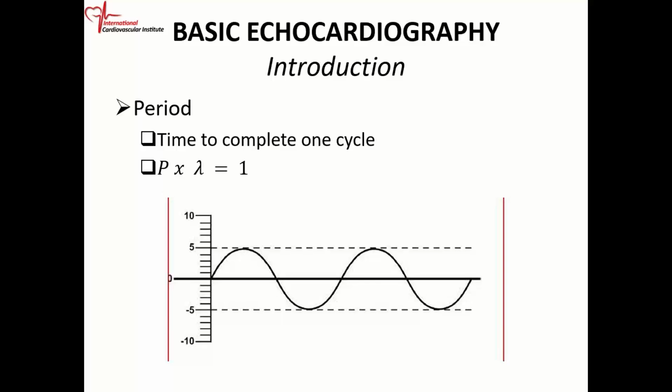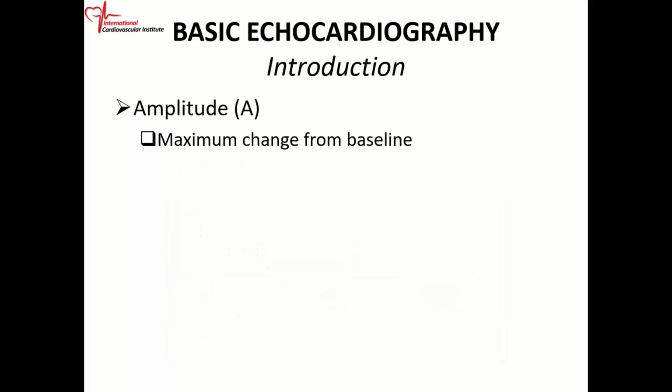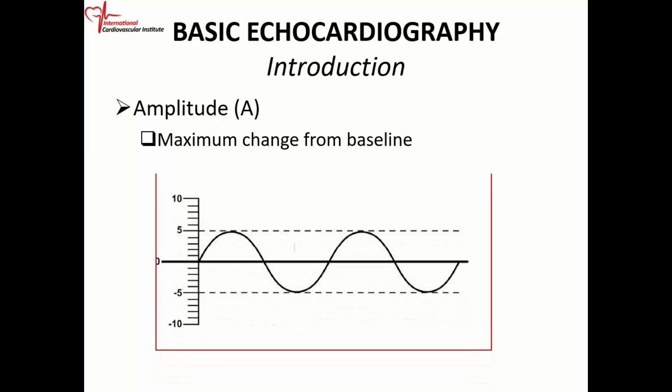Again, another pictorial showing you the amplitude. You can see this is the wavelength, or the period, the time it takes to travel one cycle. And then the amplitude is the maximum displacement from the baseline, and that's the amplitude.